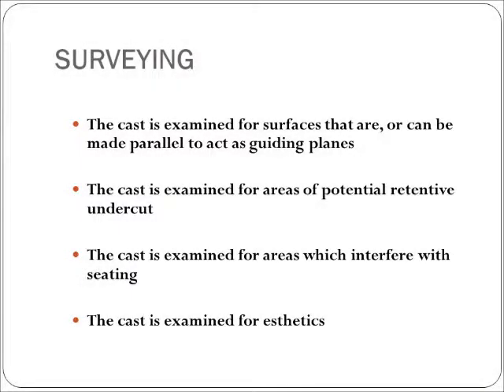Analysis of the dental cast with the surveyor consists of examination for guiding planes, retention, interferences to the path of insertion, and to optimize the aesthetic result.